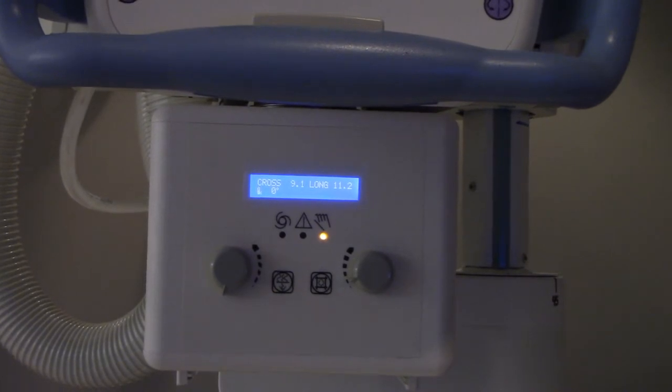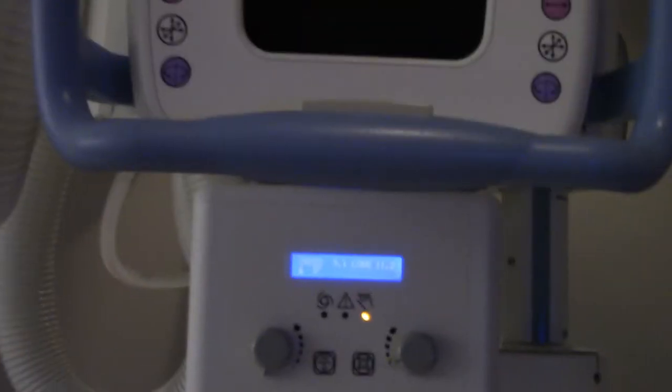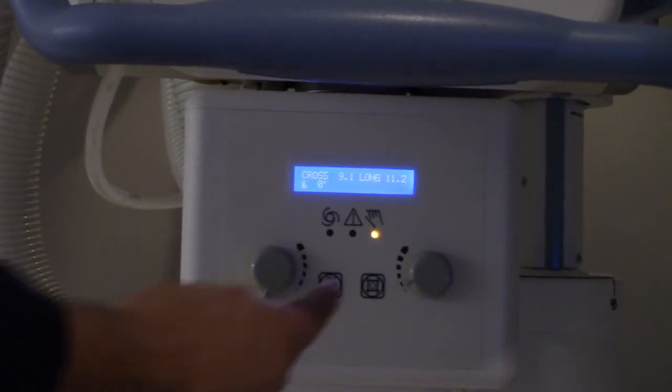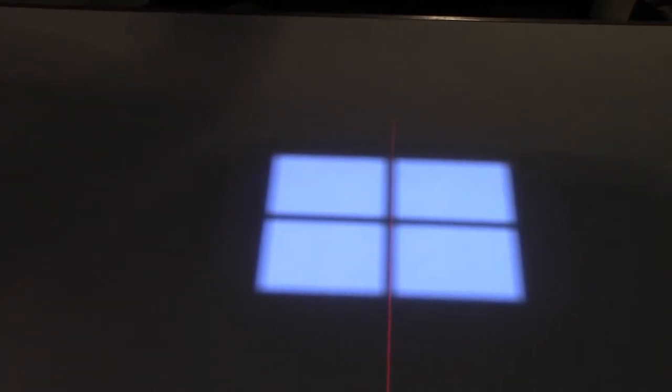I'm going to turn on my light. This is my positioning aid light. As you can see, it casts a light rectangle down on the table. It also comes complete with this red alignment beam. What that allows me to do is line up my bucky tray with my light field.